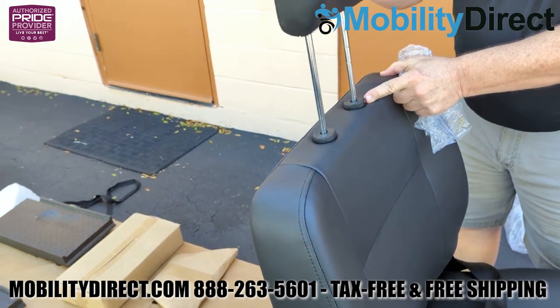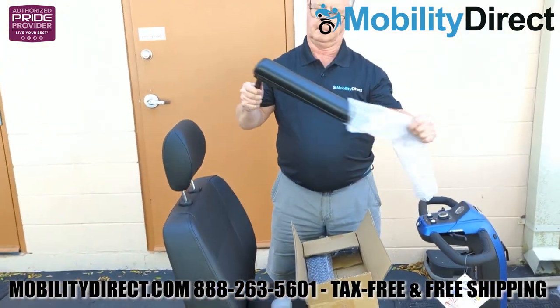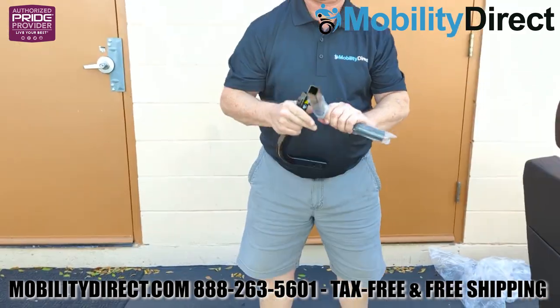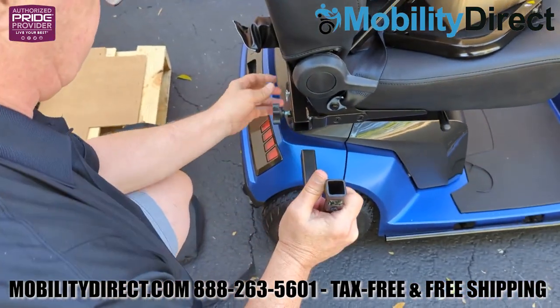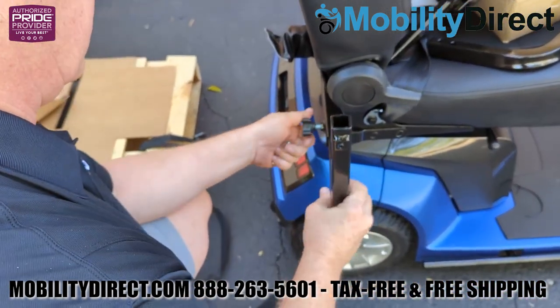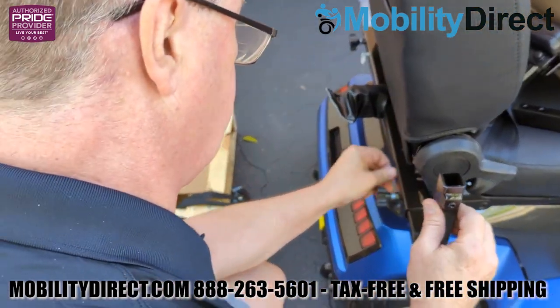Now we're just installing the headrest, which works just like an automobile headrest. There's a little tab there that you can use to adjust the height. At this point, we're going to unpackage the armrests themselves and the 90-degree elbow connectors for the armrest, which are packaged separately. Those 90-degree angles will be installed first and they're going to act as sleeves for the armrest. You'll need to loosen the tension adjustment knob and pull out the securement pin for each of the armrest rails when installing that 90-degree elbow. Slide the elbow in once you've loosened the knob and removed the silver pin, then retighten the knob and reinstall the pin.